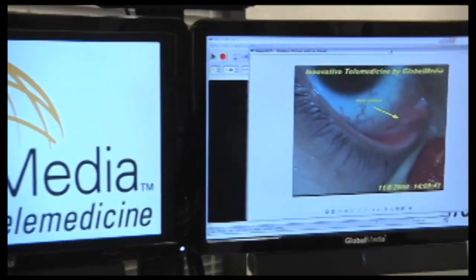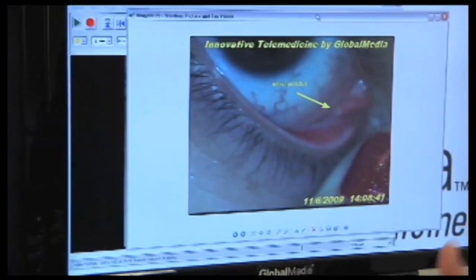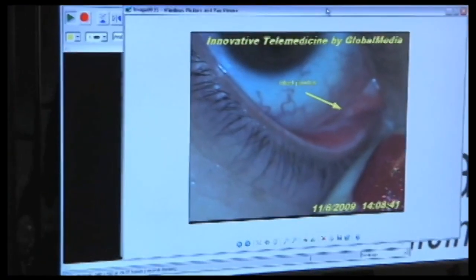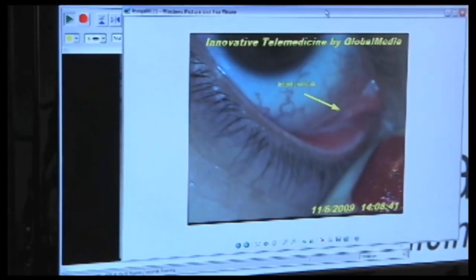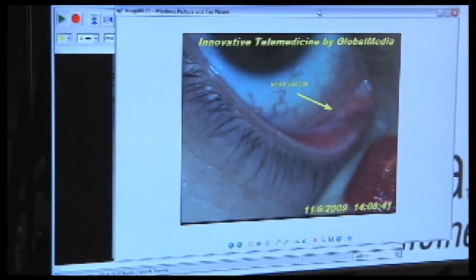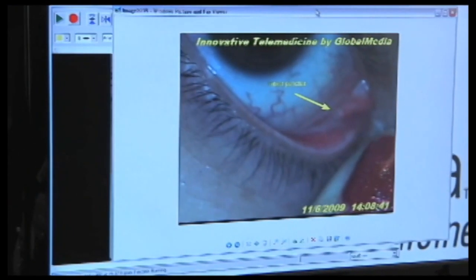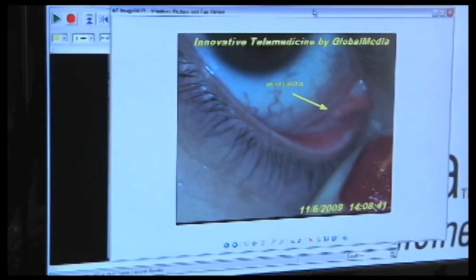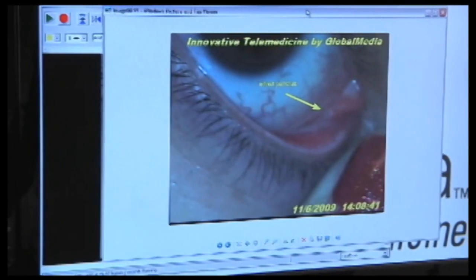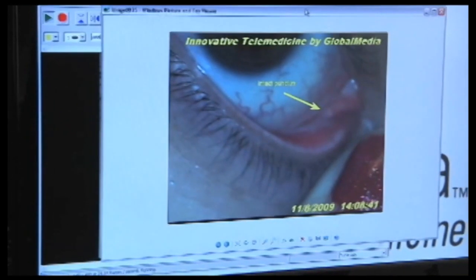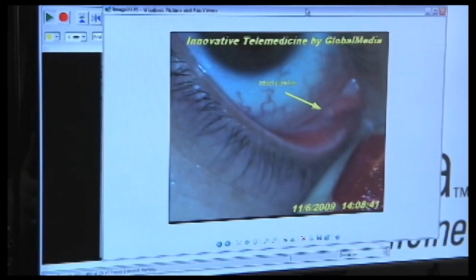So there's the image, peppered in the record of the electronic medical record. It can be in a DICOM format with all the DICOM headers. It's all HL7 compliant.